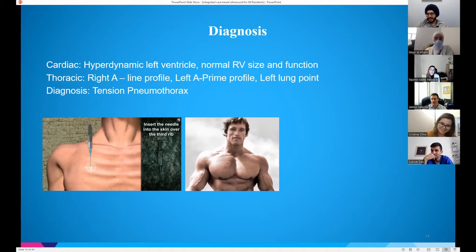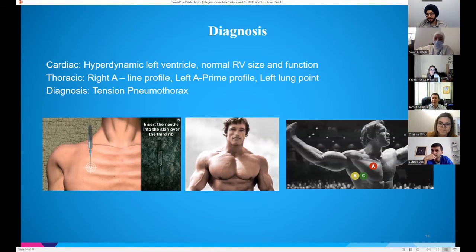We can do other, like the mid-axillary line. Beautiful. So you can go into different areas. You can go into the mid-axillary line, either the anterior or the posterior mid-axillary line, where you can get his vulnerable spot and you can stab him right there and save his life.